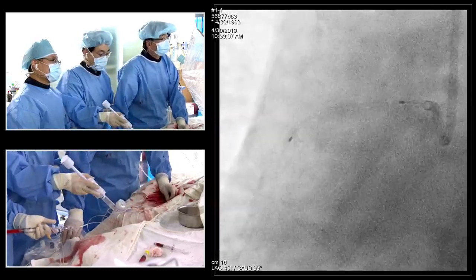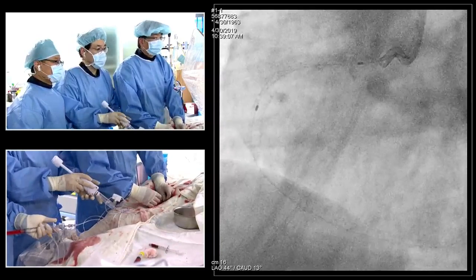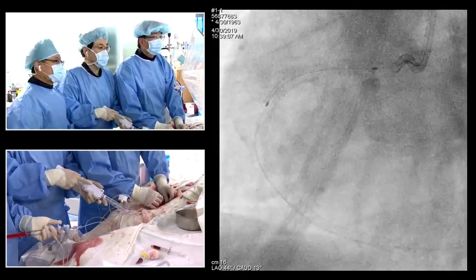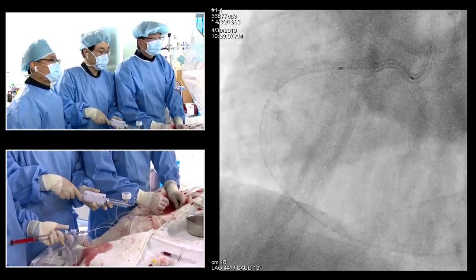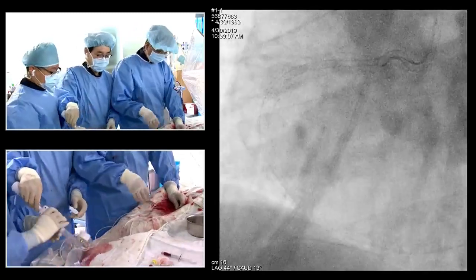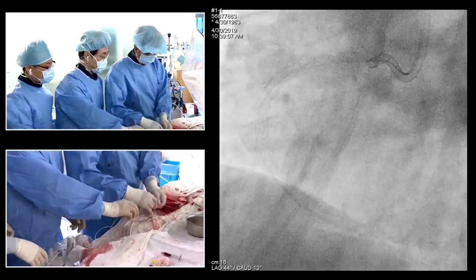So still, you're going to have to use a much bigger balloon at the distal. Yeah. So I wanted to remove that. That's one of our concerns, the chance of making the stent deformity. So always be cautious with the AL1 guiding system.